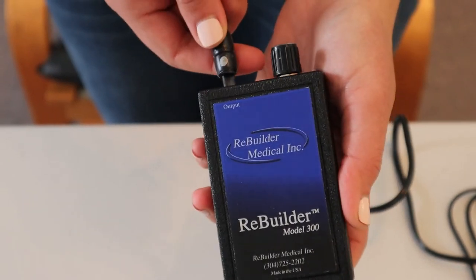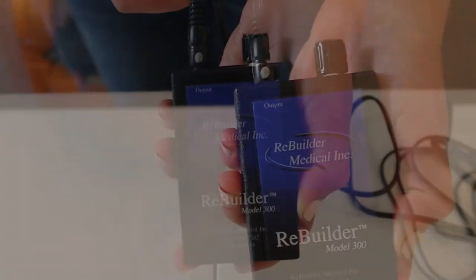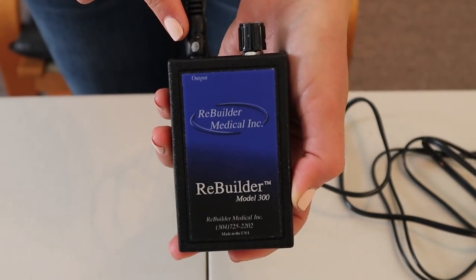Take the lead wire and insert it completely in the input jack of the Rebuilder. The silver indicator will be facing the front of the unit.